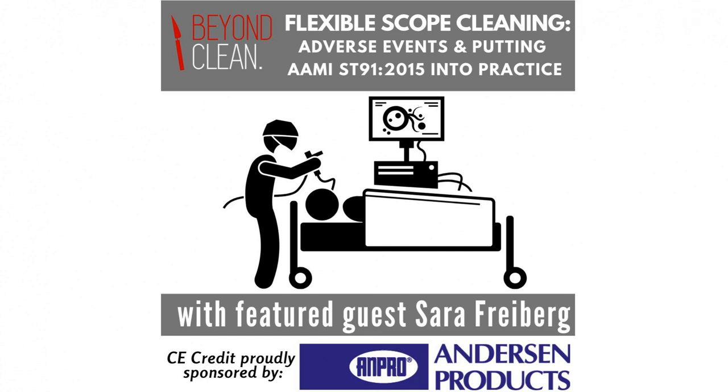And then on top of it, really proper rinsing, because if that enzymatic residue gets left behind, it can cause a tacky feeling on the outside of the scope. Enzymatic is used to break down protein, right? So nobody wants enzymatic inside of their body either. You're right about rinsing that scope under free-flowing water is definitely something that has to be incorporated that we don't see.